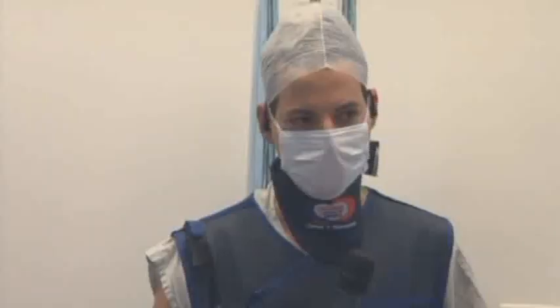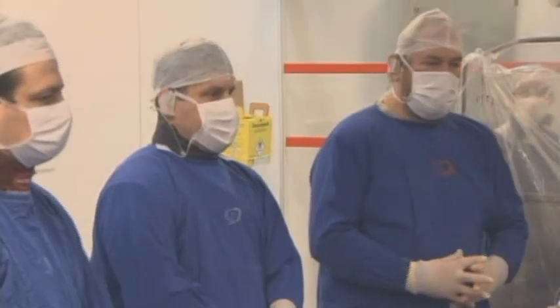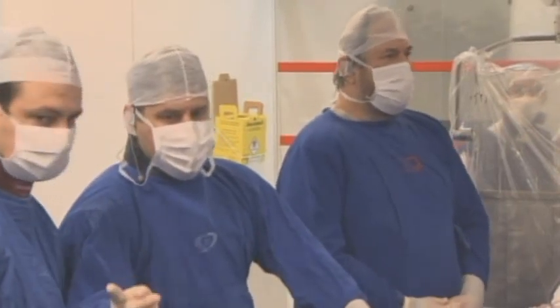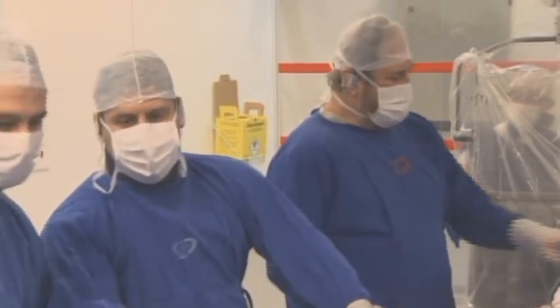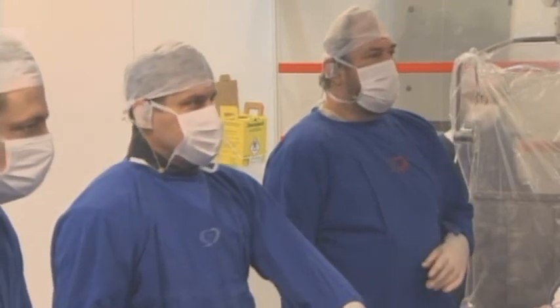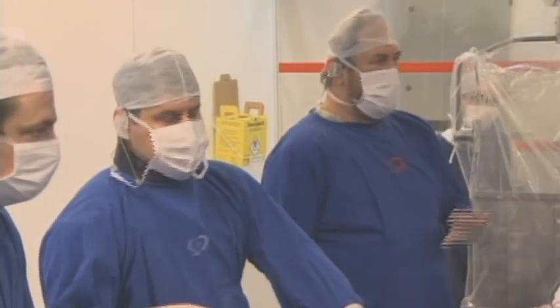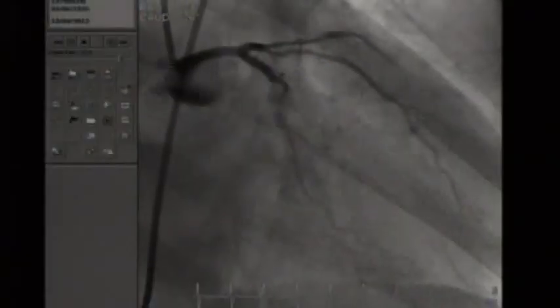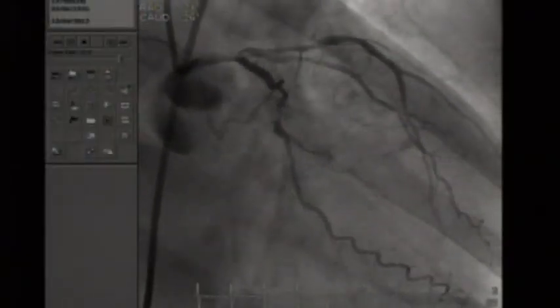Okay, Alex, do you see the case? It's a very complex case. It's a 3-arterial case. The patient is very thin, and I want to present now the scene. André will show you.